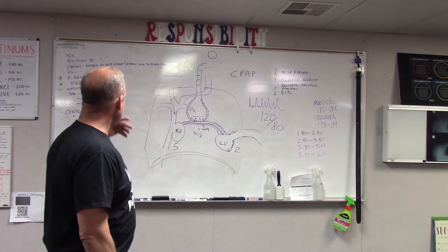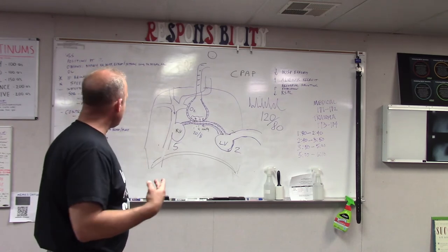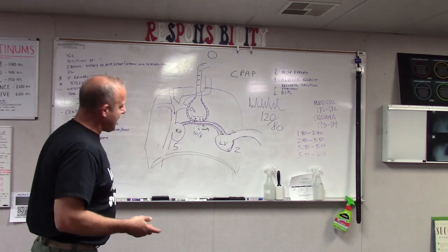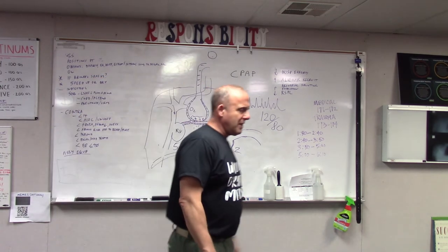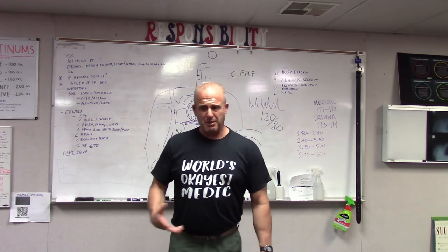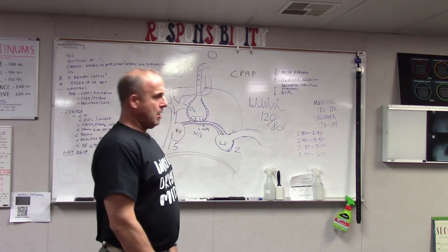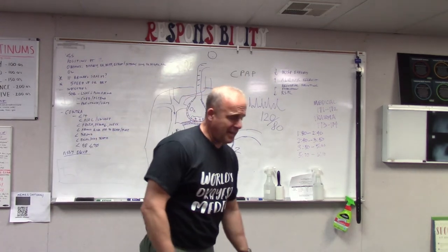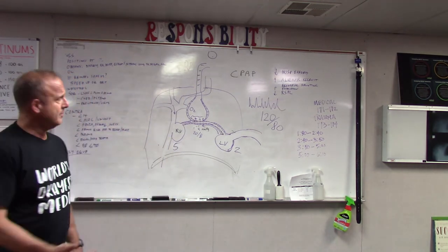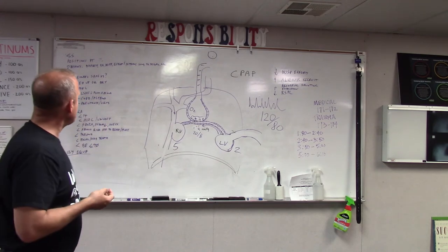If you have bronchial spasm, closure of the airways, note to self, you've got to open those airways, and CPAP may not be enough. Then we look at the pattern. Are they retaining? So they're breathing in, but they're not really breathing out. Now we know they're not retaining, but they're working to push air out. Note to self, 1:2, 1:3 inspiratory versus expiratory ratio.